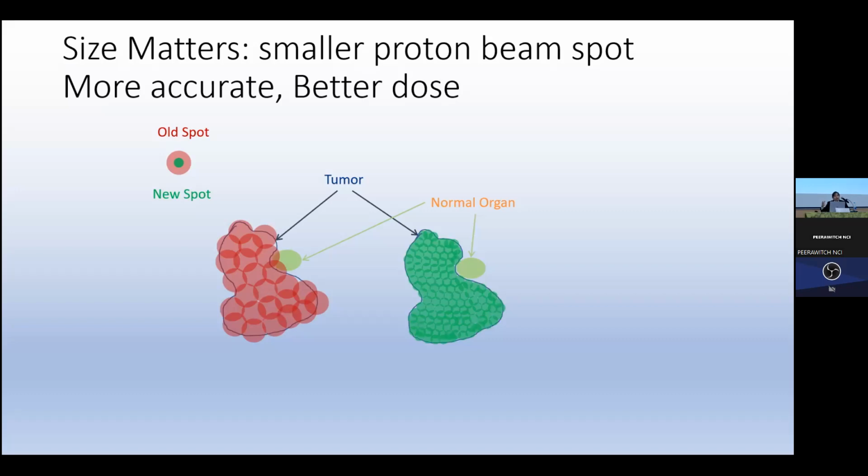I've seen other concepts where people want to do a one room system and they don't really say that, but what ends up being compromised are two things. The average dose rate gets low, and the spot size gets big. You can make a compact system where you don't compromise that, but some of the systems that I've seen, that's where they end up compromising. So it's a give and take there.